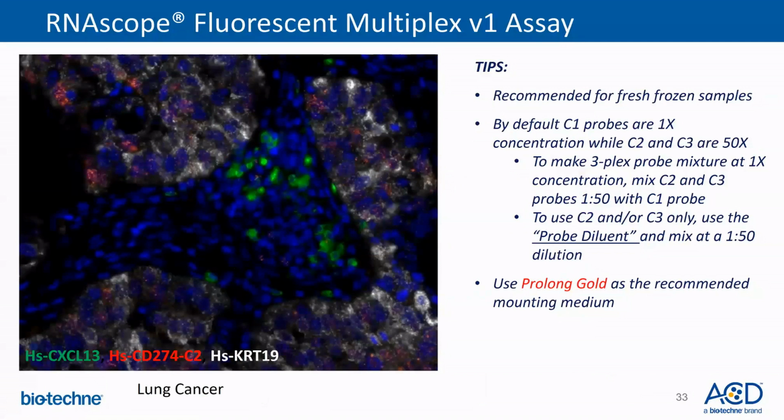Please note, we recommend Prolong Gold as the mounting media for the fluorescent assays.